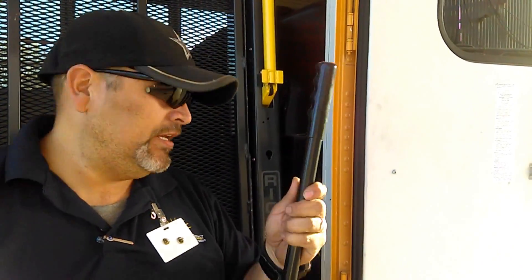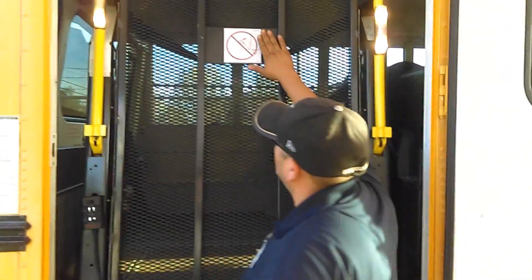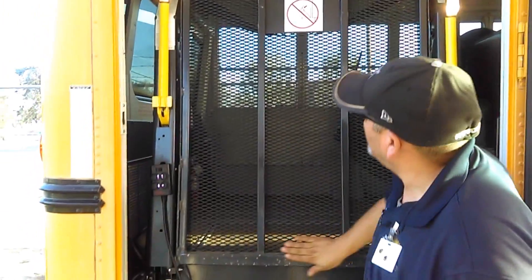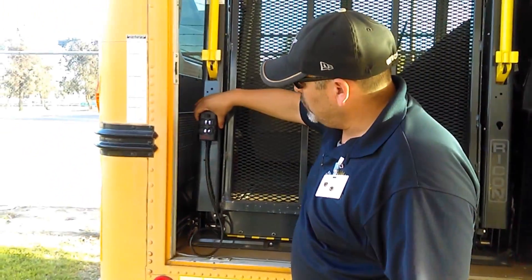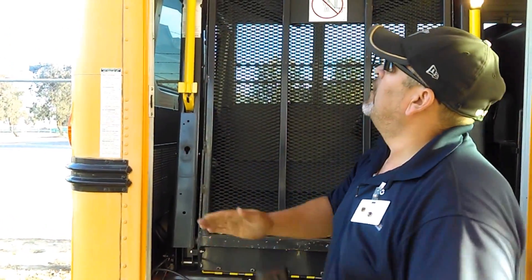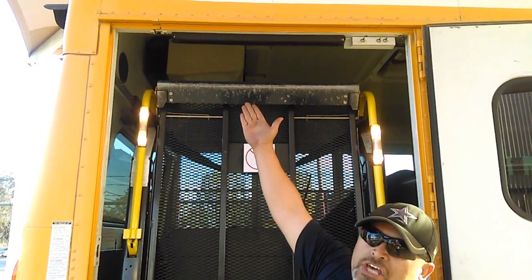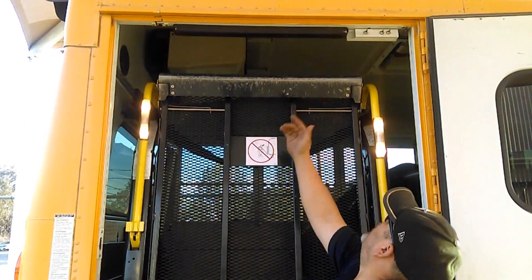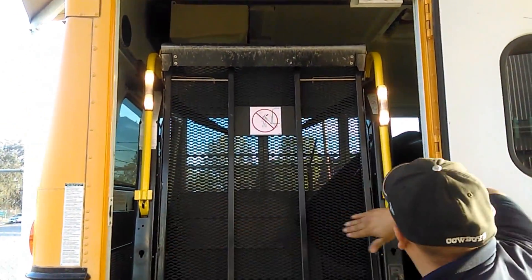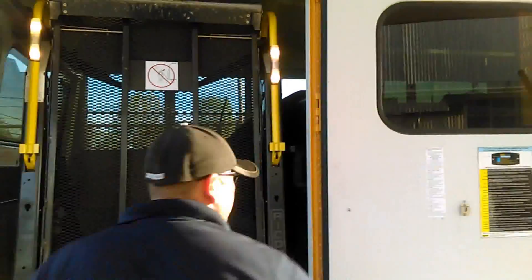I'll start from top to bottom. There are labels — they tell you to be careful as this might fall on your head. It goes all the way down; the framing looks good. I also have an electrical box that operates my wheelchair lift. There's a head guard on top that looks in good condition, not damaged or cracked. The door seal is also in good condition.